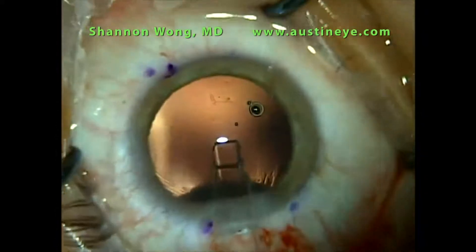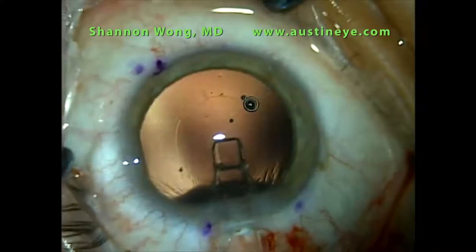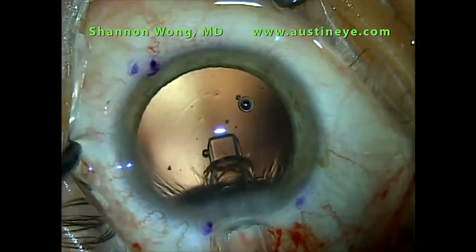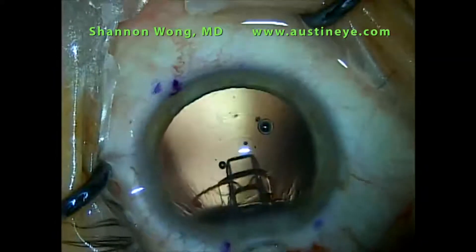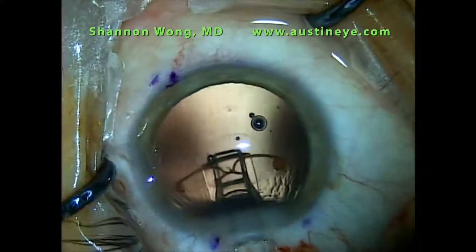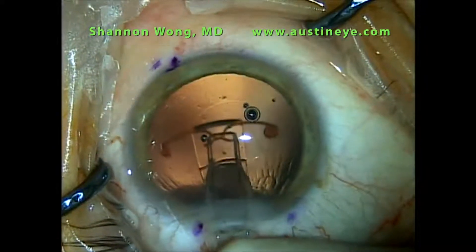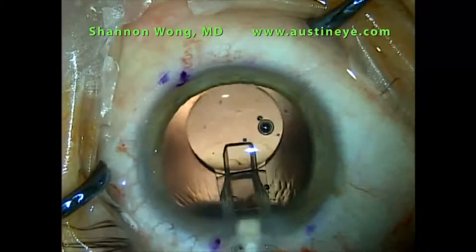I place the tip in the visual axis and then slowly inject the CrystalLens AO. I try to point the tip of the cartridge down toward the back of the eye so that the leading haptics go into the bag underneath the anterior capsule leaflets. I have both leading haptics underneath the anterior capsule.